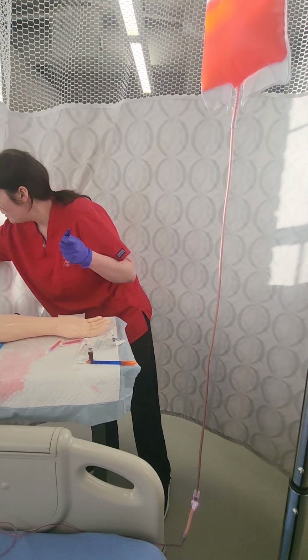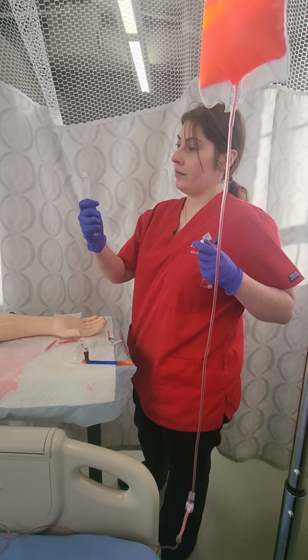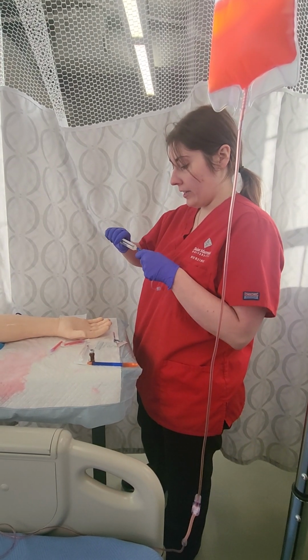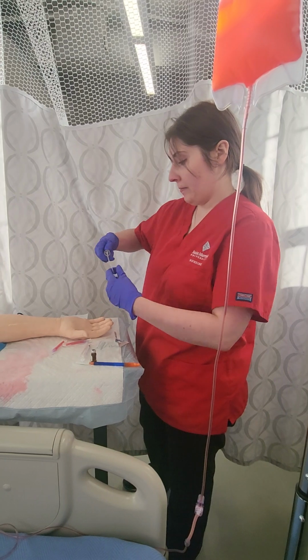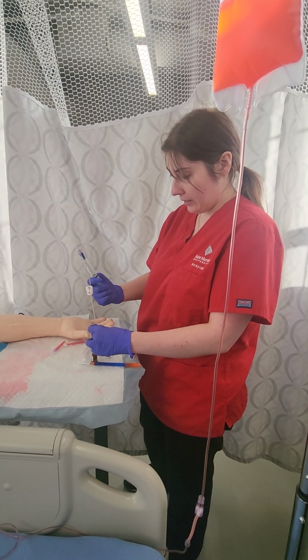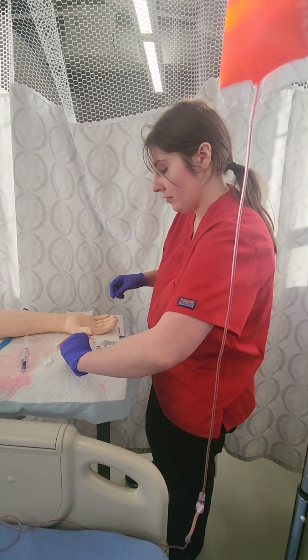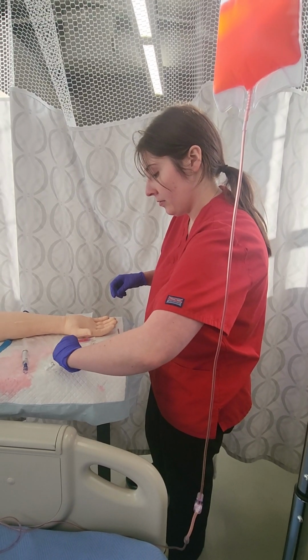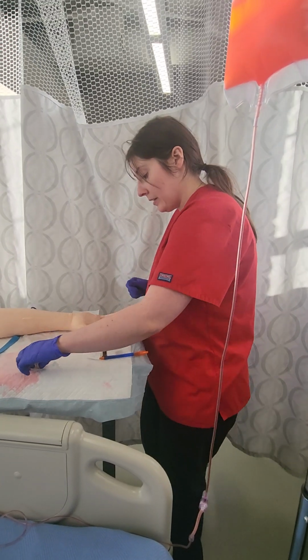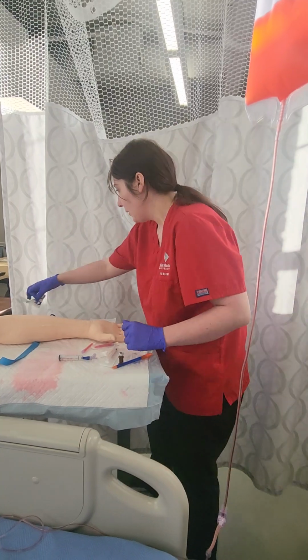Okay. And now that I'm going to do that, I would loosen the cap on here, and then I would pump this, get rid of the bubbles. Pretending there's still a cap on there. Okay, how you feeling there, Scott? No worries. Okay. Well, next.